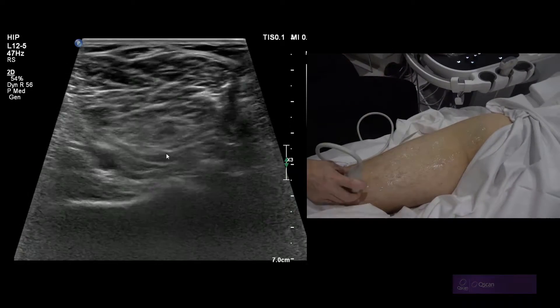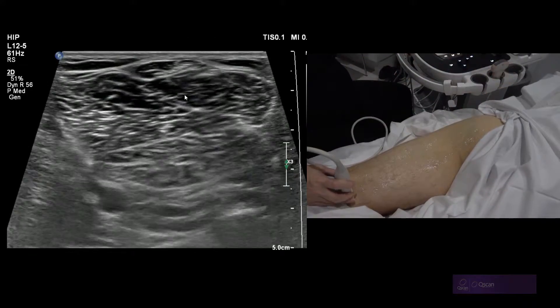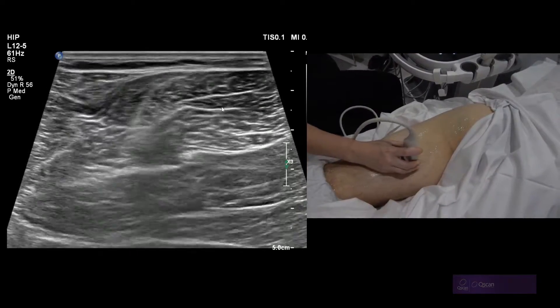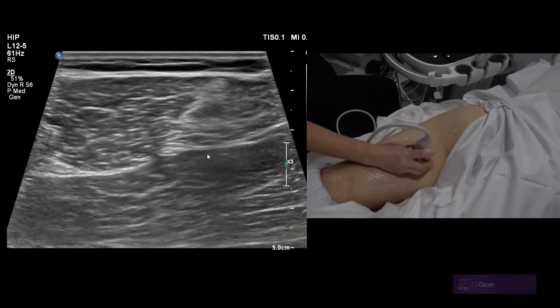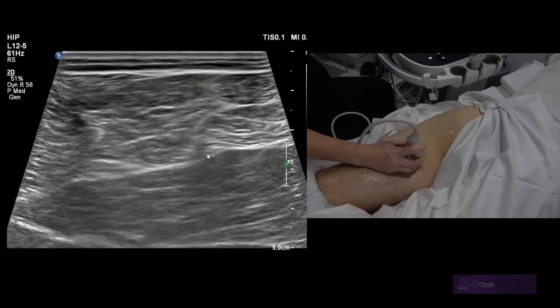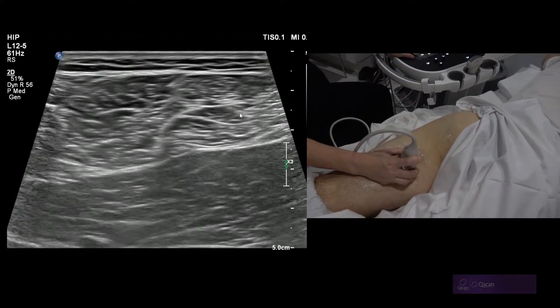If you just plump medially, you're probably familiar with semi-tend and semi-mem. I always start here regardless of where the injury is. Semi-tend is skinny at the bottom, but as you run up it becomes really large. Did you see that little white sheet that ran across it there? That's the most characteristic feature that helps you identify semi-tend — it looks like a curtain-opening zipper. Then that's semi-tend on both sides of it — all of that is semi-tend.